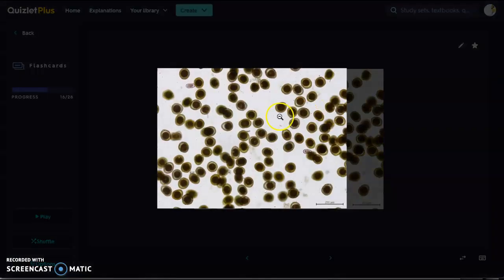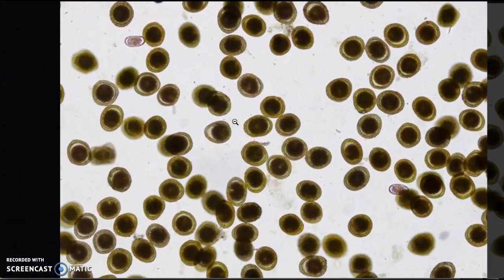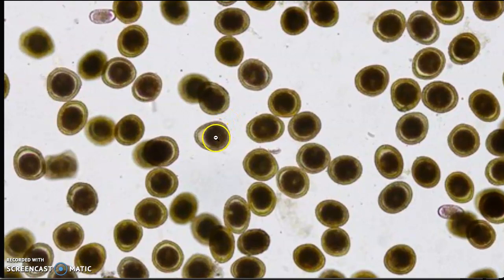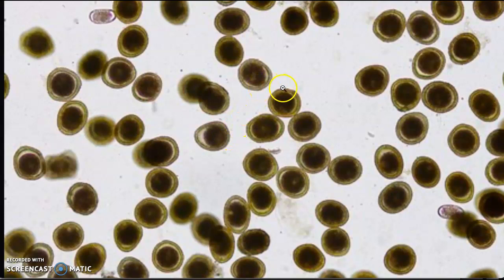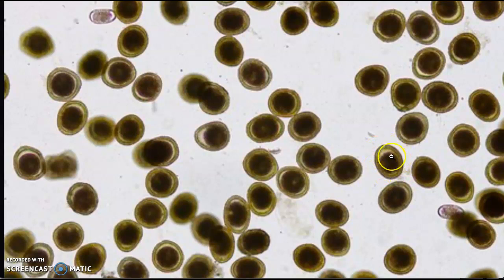Here we have the Toxocara canis eggs. These are a little bit harder to see, but zooming in you can see a nice dark fuzzy circle — very non-uniform. Where the first tapeworm eggs were very uniform in their circular shape, these are sometimes circular and sometimes more ovular. Just note that they are not symmetrical, and the shell membrane around them is fairly thin.